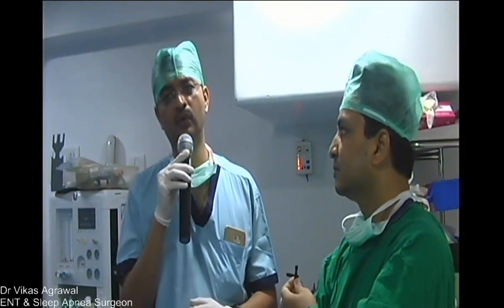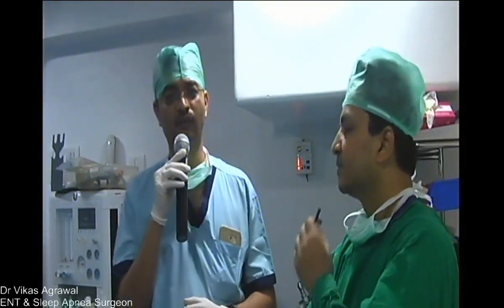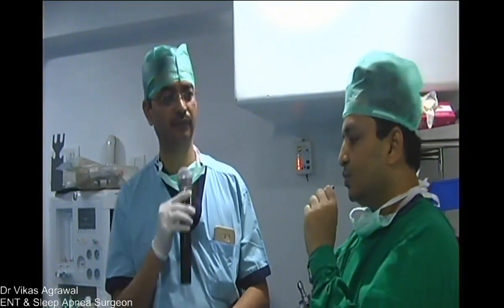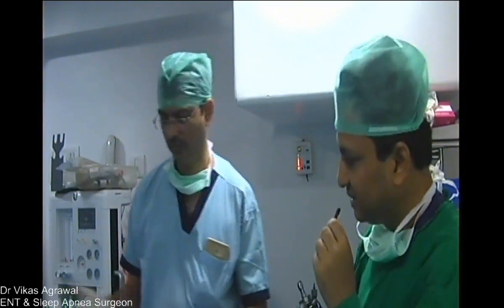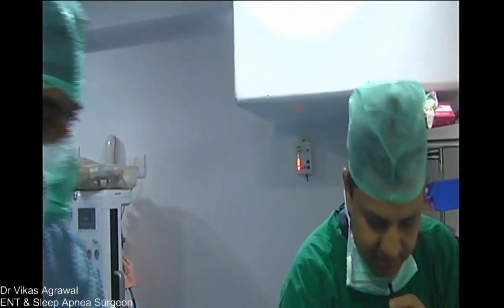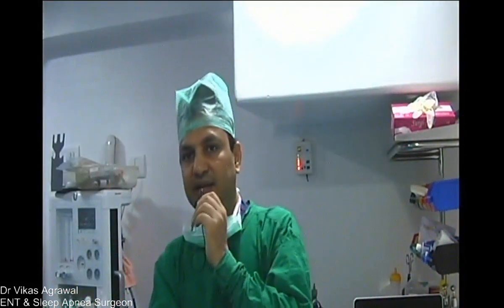So this video laryngoscope will make this intubation very easy by providing a clear view at a 45-degree angle. So there, yeah, you can take the patient and start intubating. The issue that we need to understand is that in base tongue surgery, you have to understand the whole anatomy of the patient definitely.